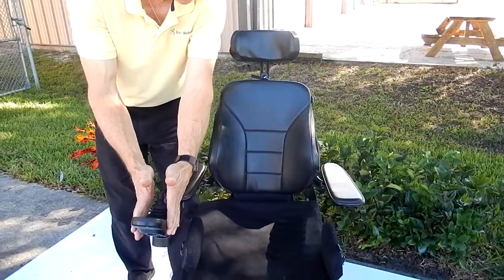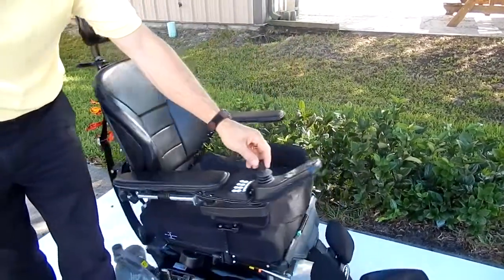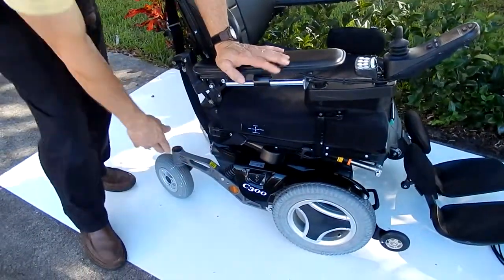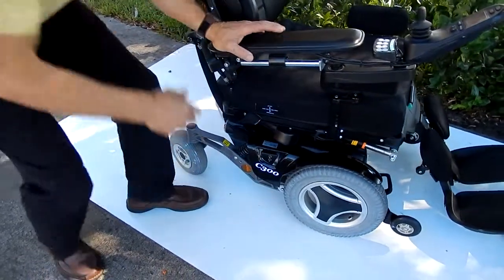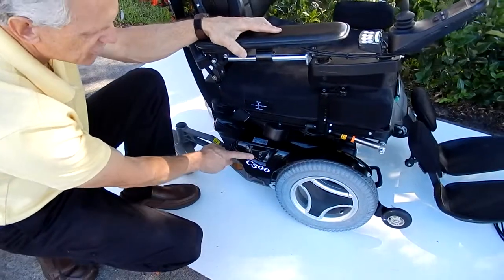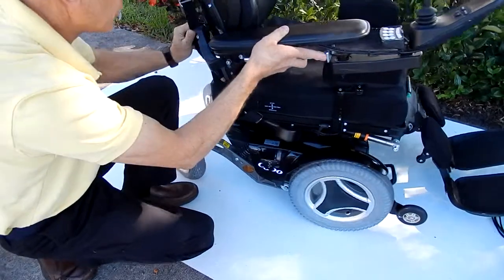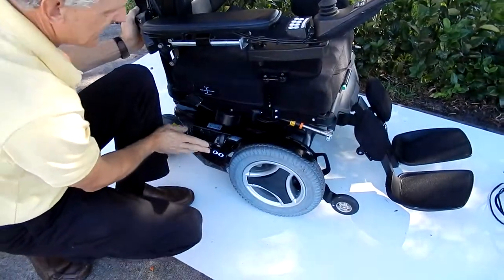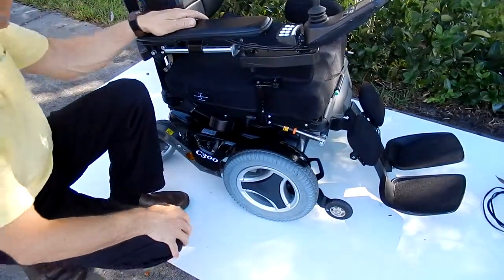The arms go up and down for easy access. The joystick can be put on the right or the left. This chair also has tie-down points — you have a tie-down point over here and tie-down points up front on each side. If you needed to put this chair in neutral where you needed to push it, there's your neutral lever right here. Pull the lever out, turn the chair off, and your chair is in neutral. Put the lever back in and those motors will be back in gear. Turn it back on and you're ready to ride again.